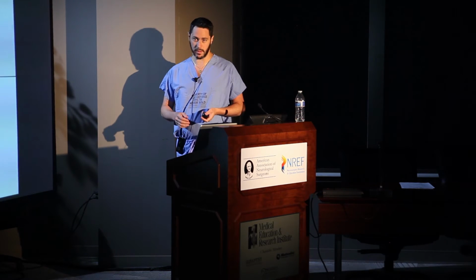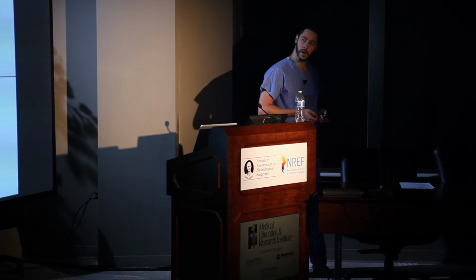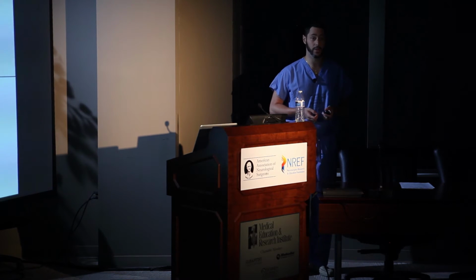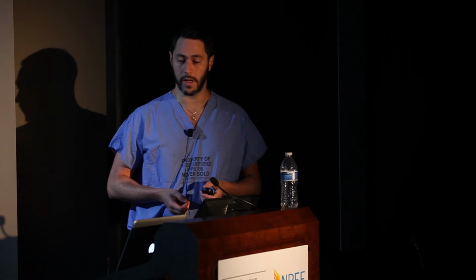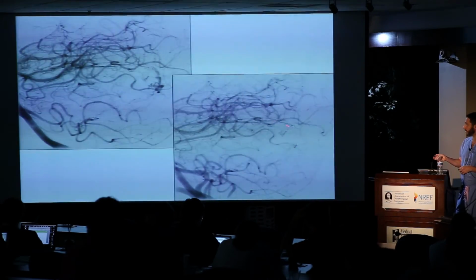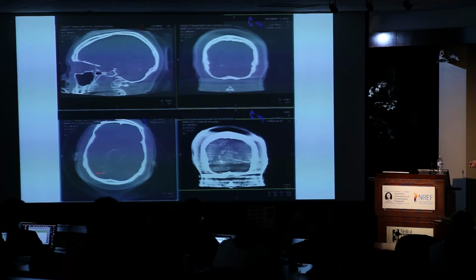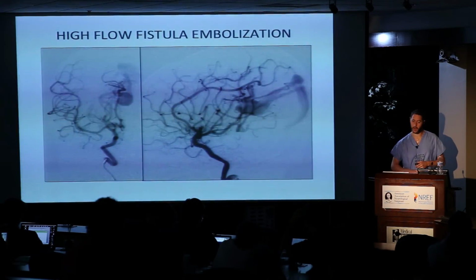Okay, so this is something I appreciate the surgeon's comments on, but a small AVM may be difficult to find in the operating room. And one of the things that we do is here's the pictures before and after. So it looks like it's gone, but remember that secondary supply. You never filled up that branch. You never really penetrated the vein well. Even though we didn't see it, we took a Dyna CT to localize our glue. That can be married to your brain navigation in the OR, whether it's Brainlab or Stealth, to help resect this. So I think that's a technique that can be very helpful.